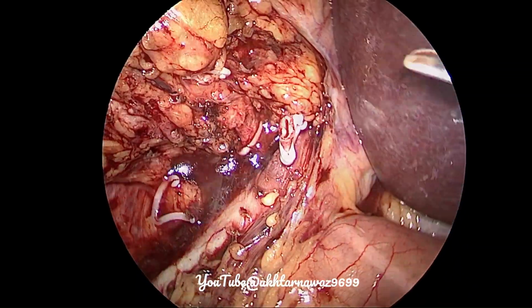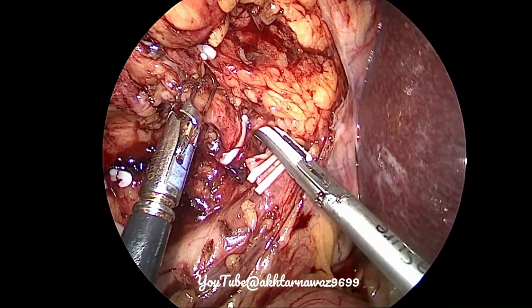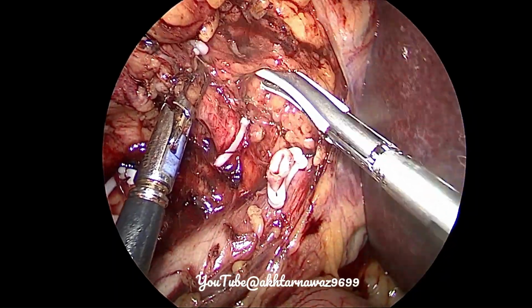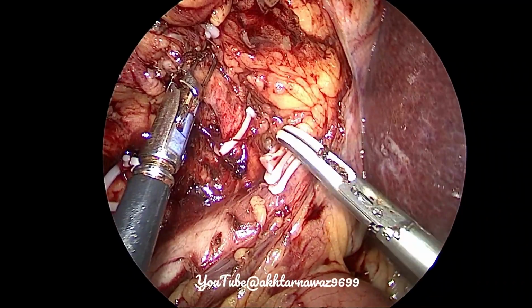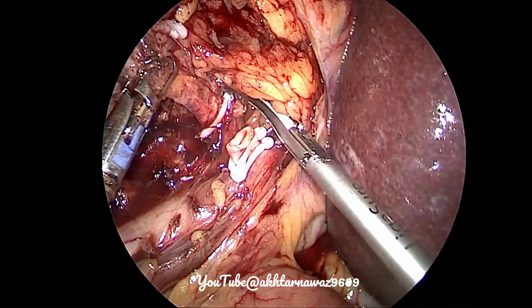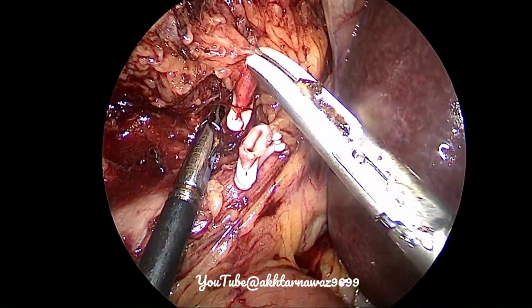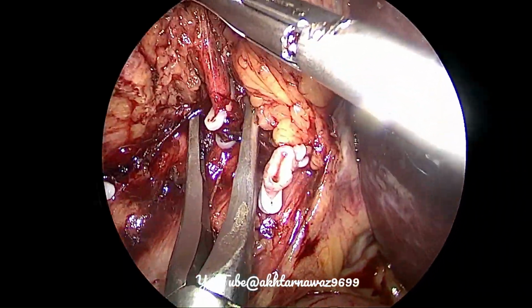of the artery. So the artery is now visible. We will try to dissect all around it. This will give us length, and this will also help us to dissect the posterior aspect of the renal artery, and we can then safely apply the clip. So the dissection is now complete.